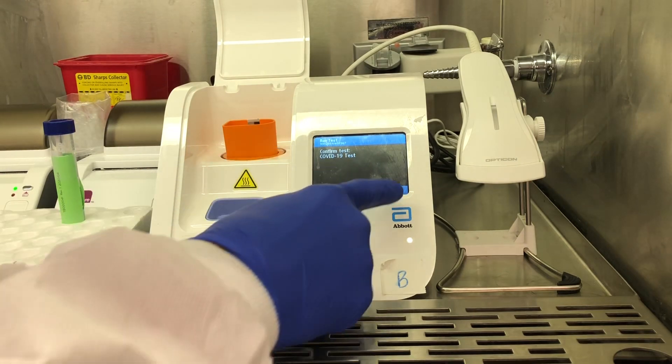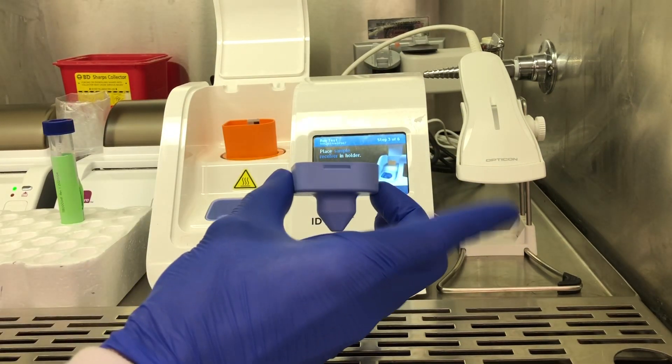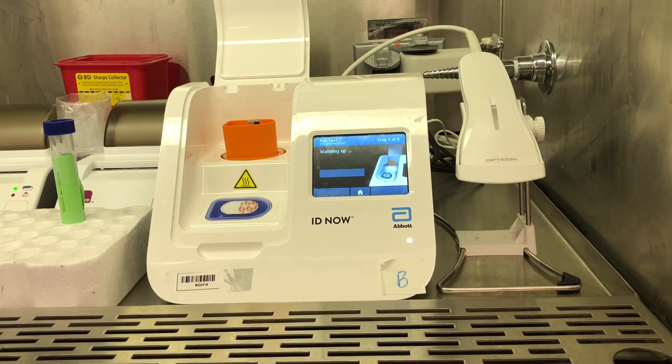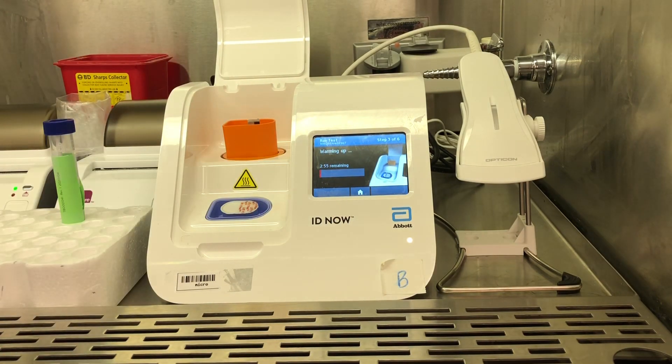It'll ask you if that is what you're trying to run. You'll hit OK, and then it'll ask you to put your sample receiver into the sample receiver holder — that is in package 2 — and it's going to run for three minutes of incubating.